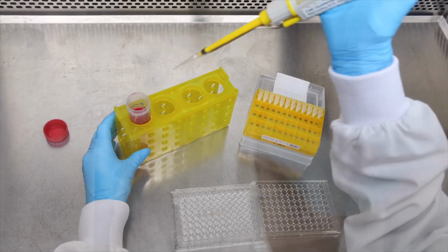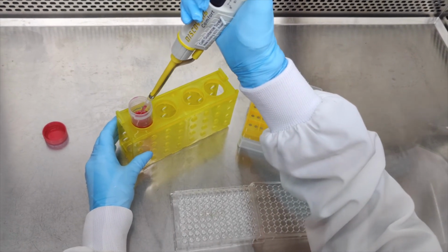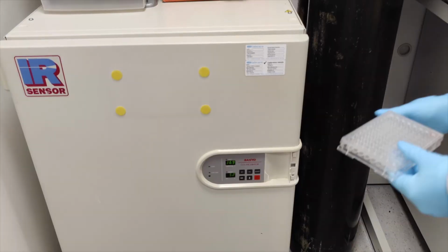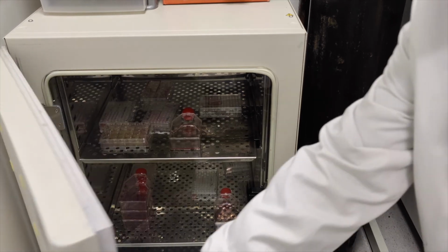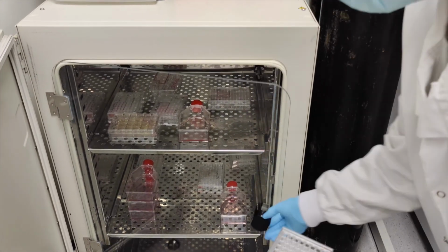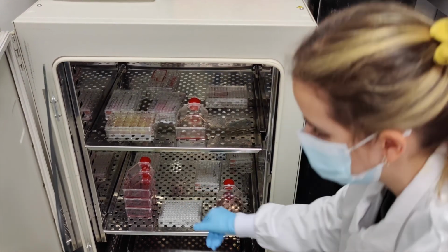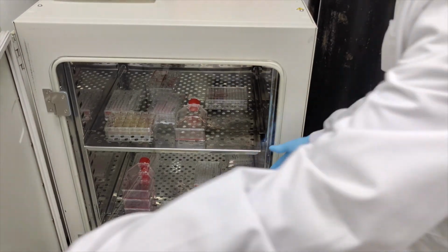Add enough cell culture media to each well to cover the PeptiGel. Place the well plate in the incubator at 37 degrees Celsius. Change the media 2 to 3 times within 1 hour to ensure homogeneous diffusion of media nutrients.